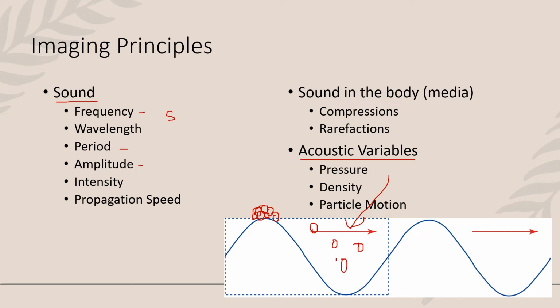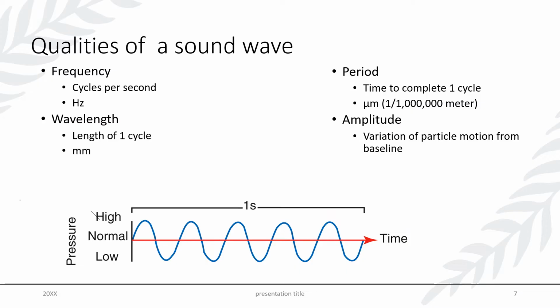Now, this consideration comes into play more when we start talking about another option with our sonography units called harmonic imaging. And so some of this will get tied together when we get to that point.